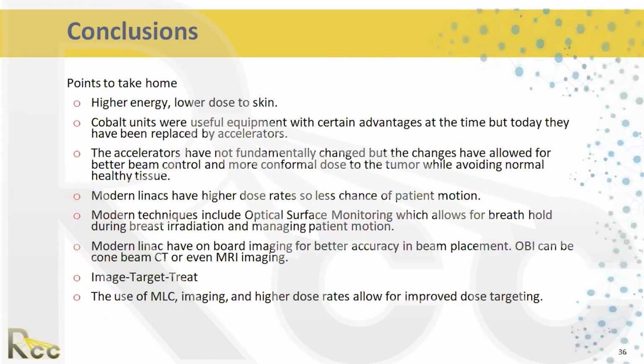They still all accelerate electrons near the speed of light. It hits a tungsten target, out comes X-ray. But what's happened is the control of that beam, the shaping of that beam, the monitoring of that beam, higher dose rates, much shorter treatment times, less chance of patient motion.